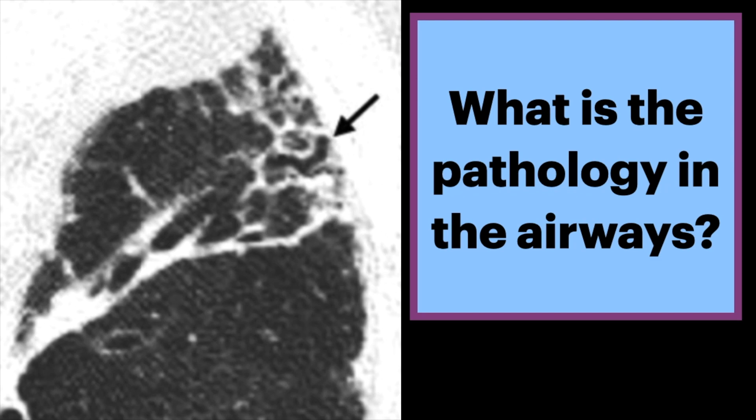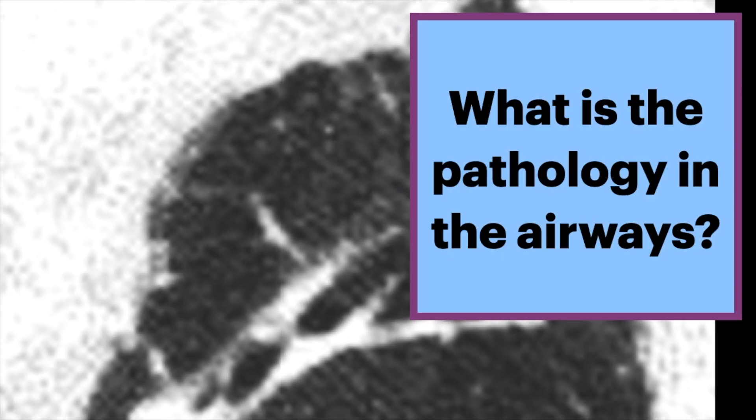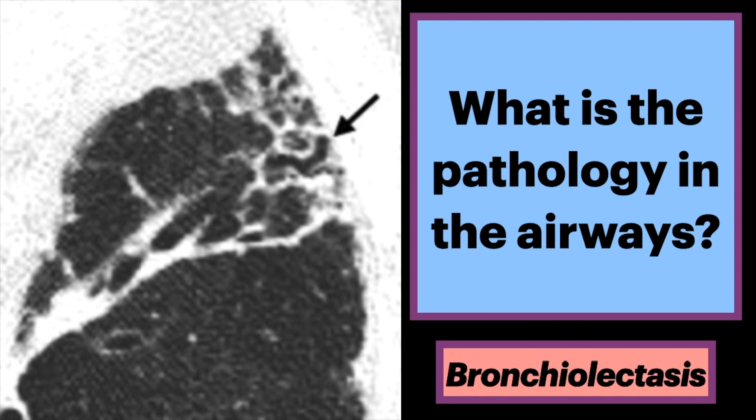What is the pathology in these airways? On this coronal CT of the chest, we see dilated bronchioles appearing as small cystic tubular airspaces in the periphery of the lung. The answer is bronchiolectasis.